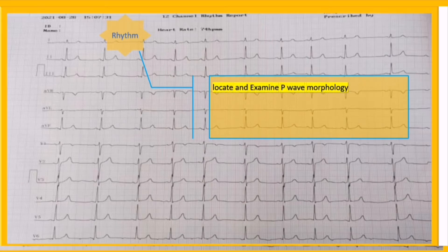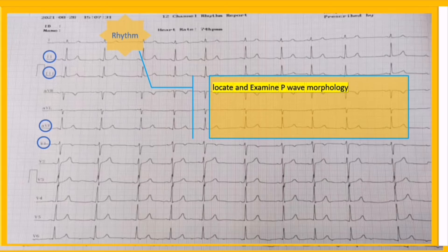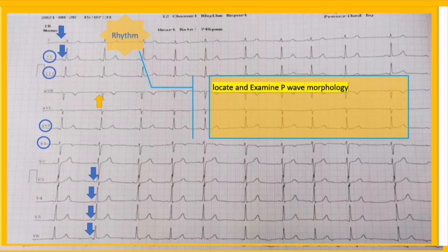The best leads to identify P waves are D2, V1, and other inferior leads, in order of importance. In this strip, arrows are showing the P waves. They are morphologically identical and upright in D1, D2, V3 to V6, and negative in aVR. This establishes that the rhythm is originating in the sinus node.